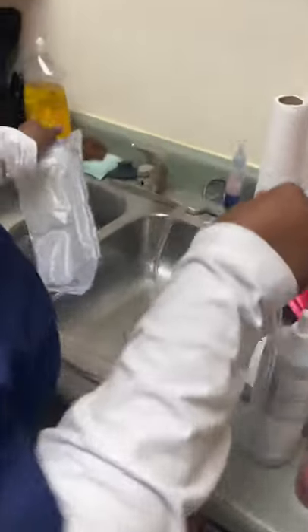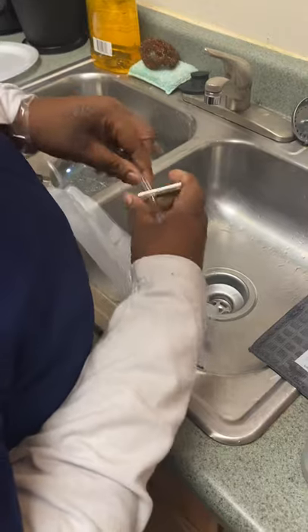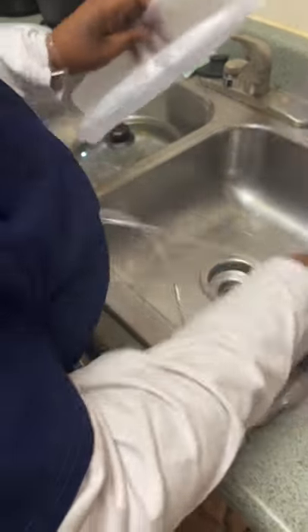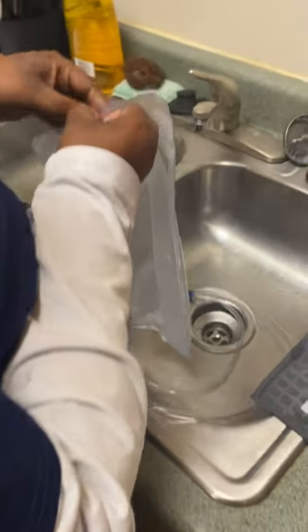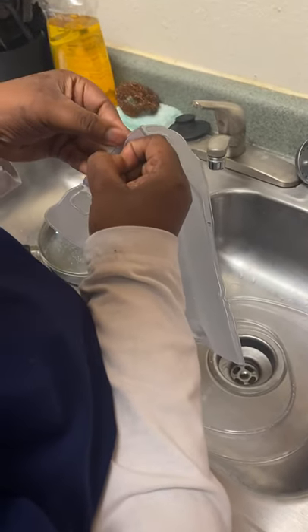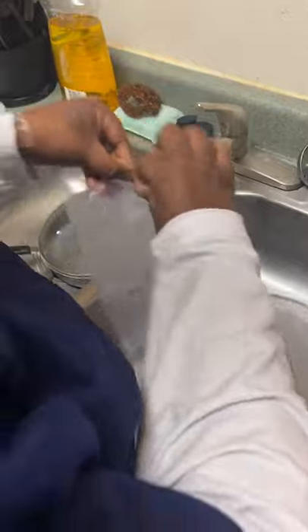I'm going to come over to the sink. I'm going to make sure that it is clamped. I'm going to fill it with between 750 to 1000 milliliters of water, making sure that the water is flowing from the bottom of the sink.